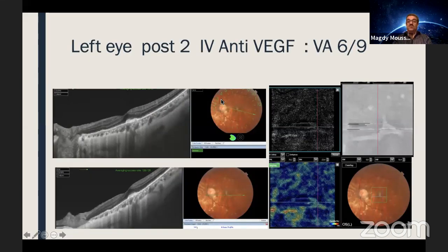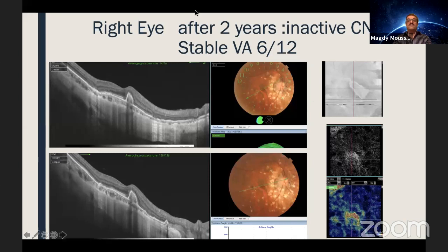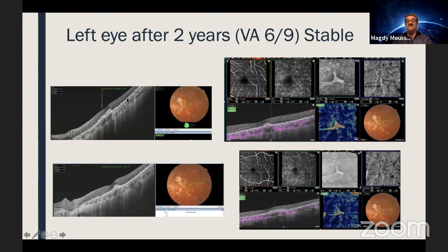Even with the rheumatologist's treatment ongoing, I started injecting her. After two intravitreal anti-VEGF injections she regained good 6/9 vision — I caught her very early. Though structural OCT shows not much, the elevation is a little less and the flow is minimal. After two years the right eye has 6/12 vision. The OCTA shows minimal flow — not conclusive alone. I count on structural OCT, patient symptoms, and the fact there's no fluid and no metamorphopsia. The left eye: two years later she still has 6/9 vision. The CNV was parafoveal and the fovea was spared — so she still has 6/9 vision after three years of follow-up.